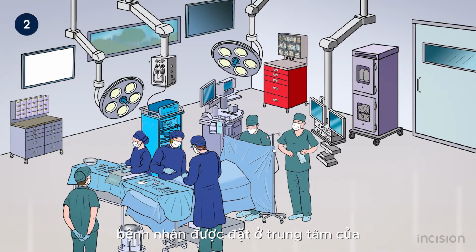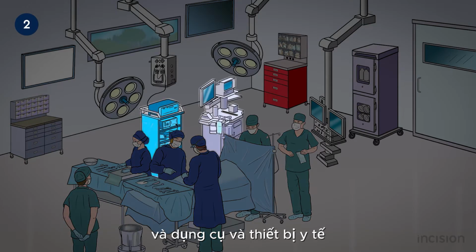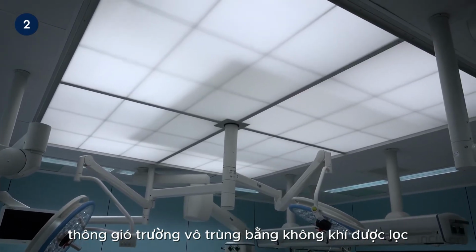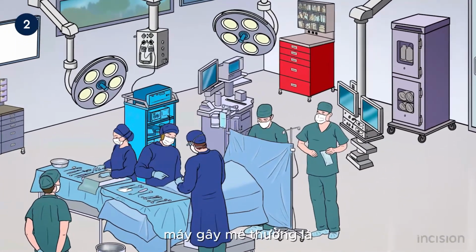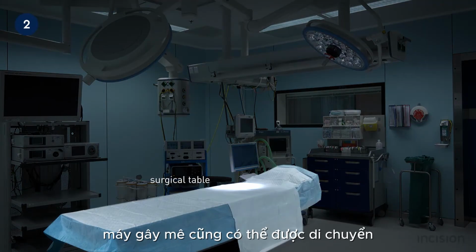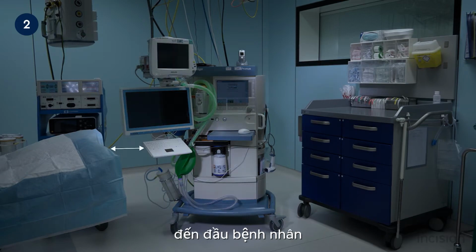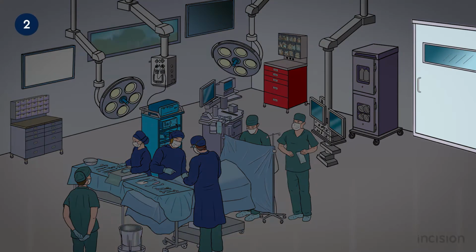The patient is positioned in the center of the operating room, so he is optimally surrounded by the operating team and medical instruments and devices. A panel above the surgical table ventilates the sterile field with filtered air. In order to administer anesthesia easily, the anesthesia machine is usually at the head of the surgical table. If it is required to reposition the surgical table, the anesthesia machine can be moved as well, in order to maintain a close distance to the patient's head. The machine should ideally be located close to the door, allowing quick access for the anesthesiologist in case of an emergency.